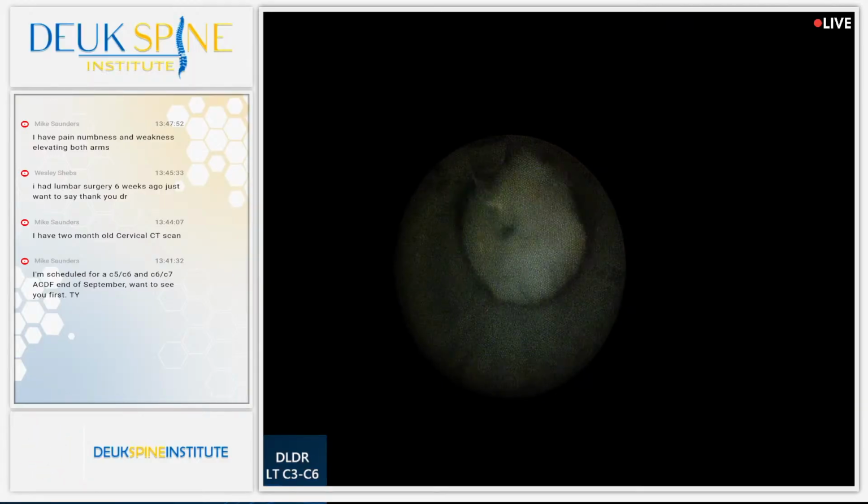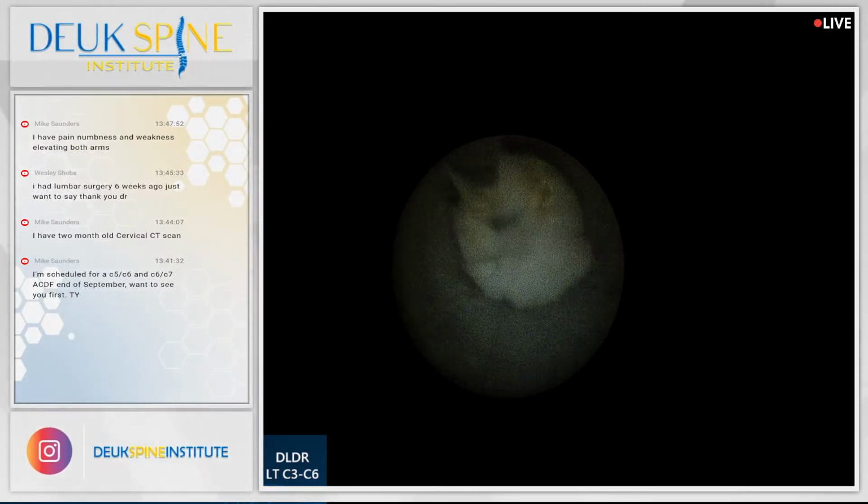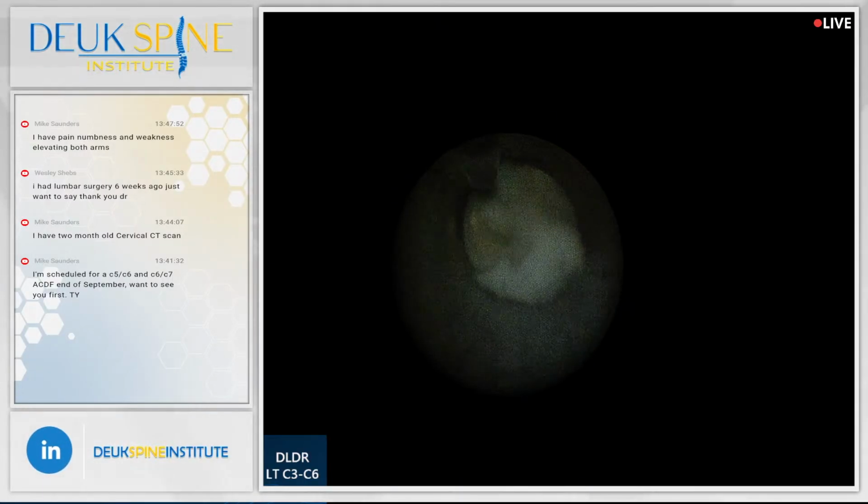You can see all the inflammation there. You guys see the red stuff, the pink stuff? That was all inflammatory tissue. You can see it? That was her body trying to heal this thing, but not being able to, unfortunately.